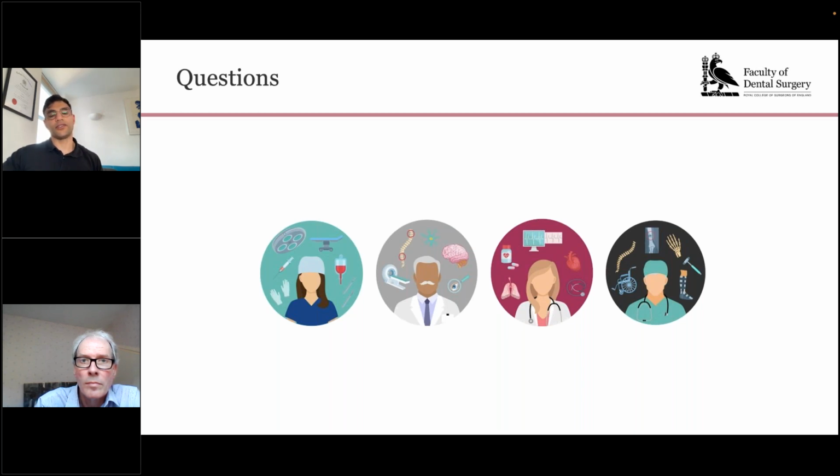And in that particular instance, if I'm understanding the heart of your question correctly, what you want to do is put the least imposition on that parent as possible. If that means they can use the camera phone they've got in their pocket to take photos of their child's teeth as quickly as possible without having to think about it or get something additional, then I think that's probably an overall benefit compared with a higher quality photograph when all you're trying to do is screen. So good luck with your research project, and those are my thoughts really. You want the least imposition on the parent as possible and to get the most benefit for that.